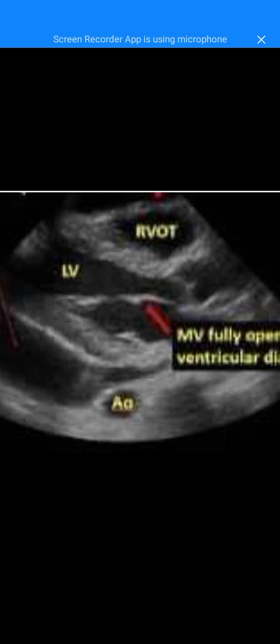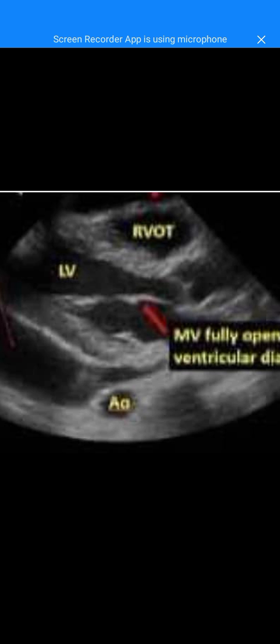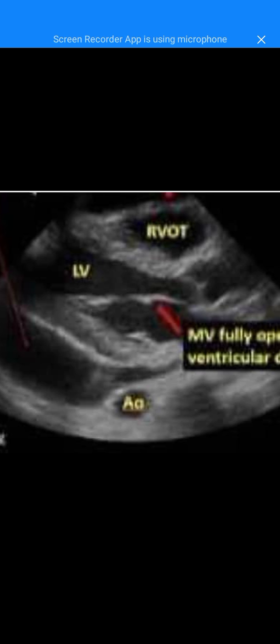Then posterior to the left ventricular wall is the bright echo, a thin bright echo that we see. From there, we see a clear echo-free zone. And as we move posteriorly, we are seeing the structure there labeled AO, which is aorta.